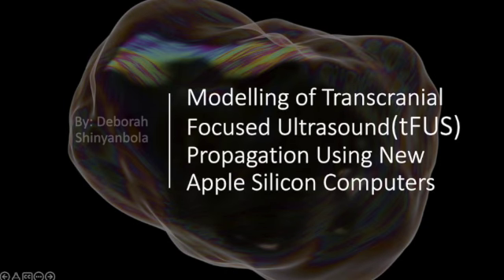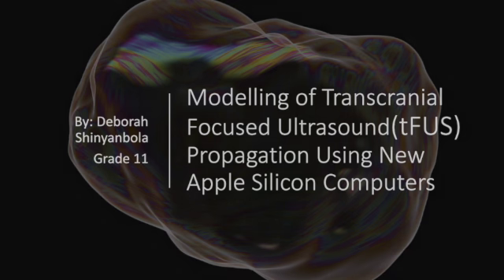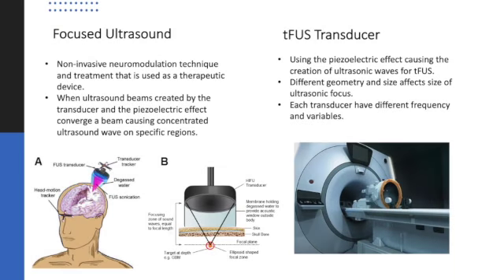This project is the modeling of transcranial focused ultrasound propagation using new Apple Silicon computers by Deborah Shinyan-Bola. What is focused ultrasound? Focused ultrasound is a non-invasive neuromodulation treatment and technique used as a therapeutic device.